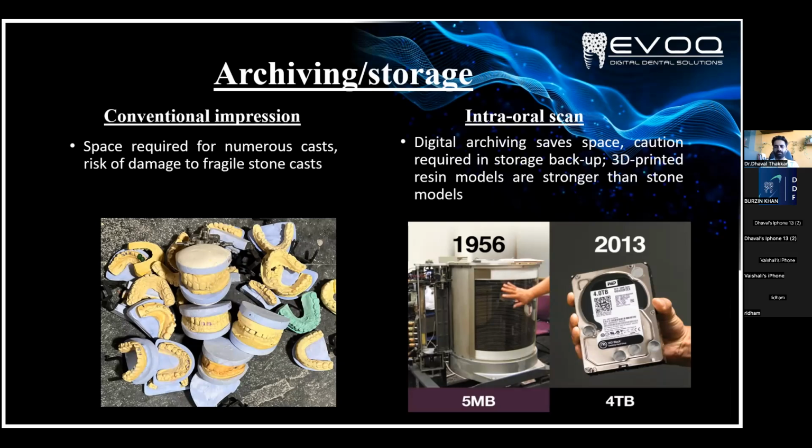And we can easily recall the data whenever needed. The same way, we can provide the patient's file to the patient also. They can store the data also. If the patient is traveling outside somewhere, the patient just needs to send us the file and we can immediately rework on the particular patient's data. So that's the biggest advantage of the intraoral scanner.